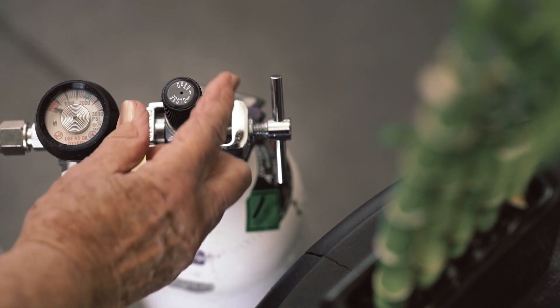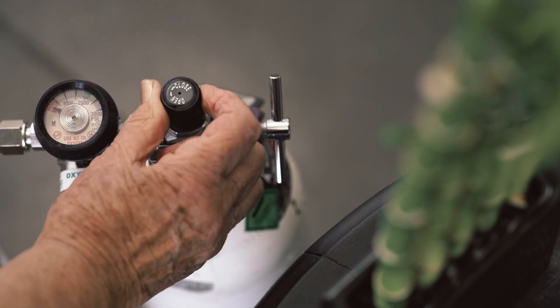If you are using supplementary oxygen, make sure the oxygen flow meter is turned off at this point.